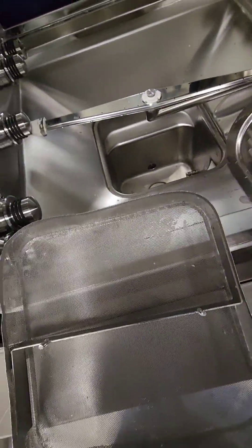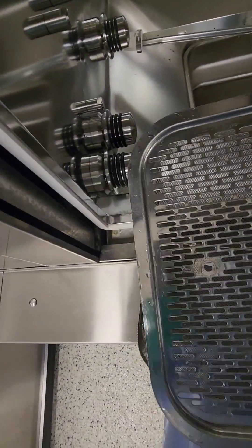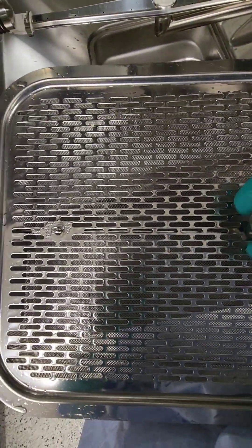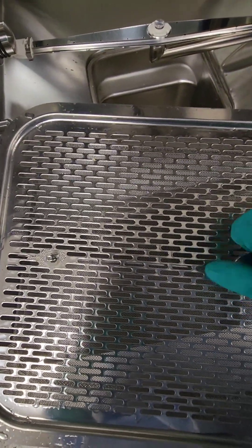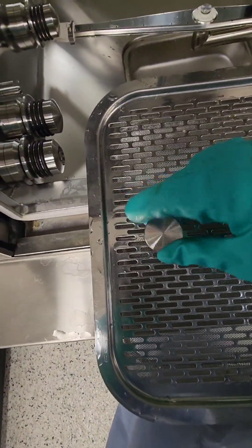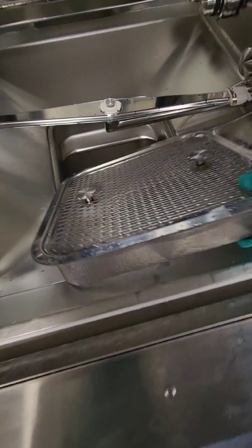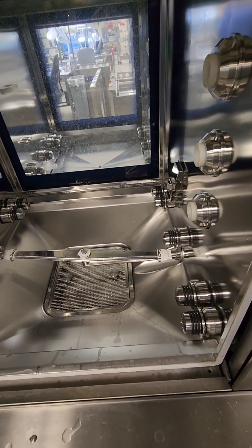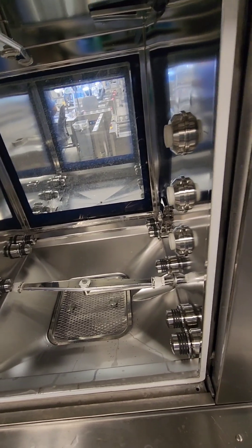Put the pump drain screen back in, then reinstall the washer disinfector basket screen. There's a cover that goes on top — line up the thread screws, put the thumb screws on, and lightly tighten them. Do not over-tighten, because as the unit heats and cools the metal expands and makes screws very difficult to remove. We have four washer disinfectors, so repeat this process for all four units in your facility.